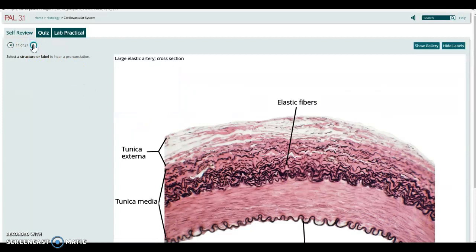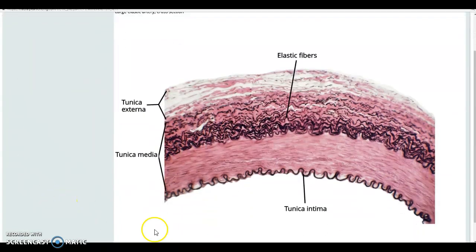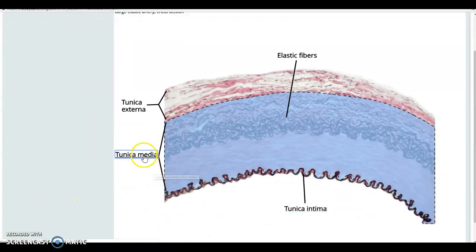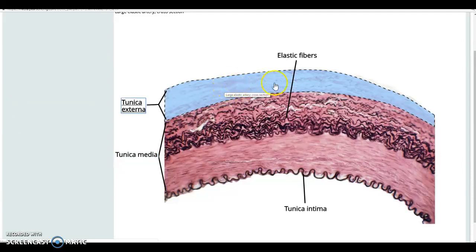This is just showing an even larger artery, something like the aorta, that tunica intima, the tunica media, very thick, nice thick muscular layer, lots of elastic fibers because those bigger arteries have to be able to handle the stretch as they get the pumping of the heart in systole pushes large amounts of blood through them and the tunica externa, the connective tissues around the outside.